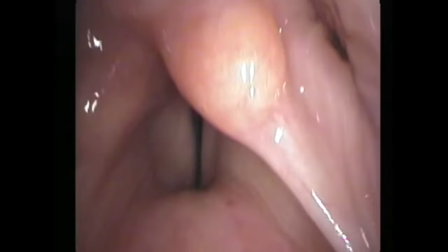This suggests that she had an injury in the past on the left side and it recovered - this is dyskinesis on the left side. She's still somewhat functional with it because it's incomplete, but it is inappropriate abduction. When she goes to phonate, the left vocal process moves through a small range, but in an appropriate direction at an appropriate time, and it seems to even reach the midline.